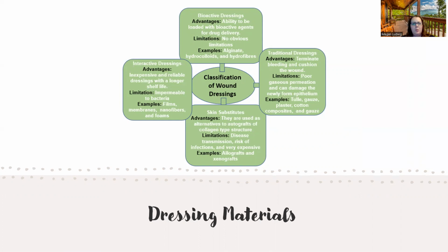You don't want to rip their skin just by tape. That can happen. Allergies, sometimes they're allergic to certain types of dressings. So those are all things to consider. Burns are going to be dressed differently than your typical surgical incision. So I wanted to show you some of these wound dressing classifications.